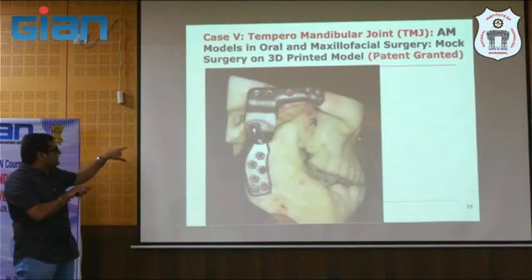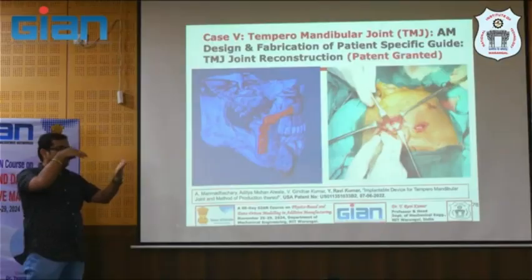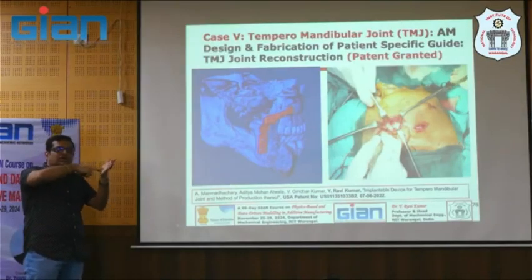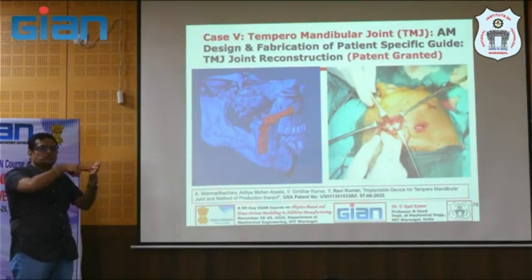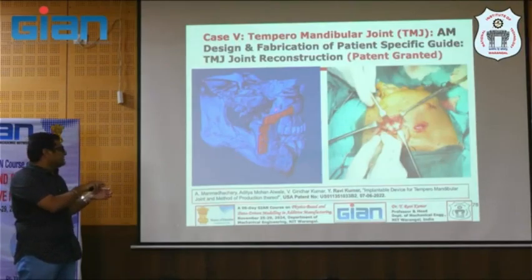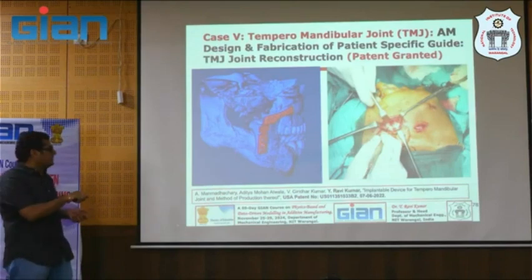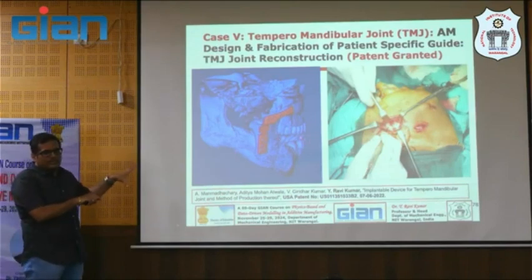And we design a template also. Why? Because the surgeon has to drill holes and fix the screws. Just like that, he or she cannot drill, since it is patient specific. So these are the templates. They will get standard templates also, but that won't work out, because this is a patient-specific requirement.